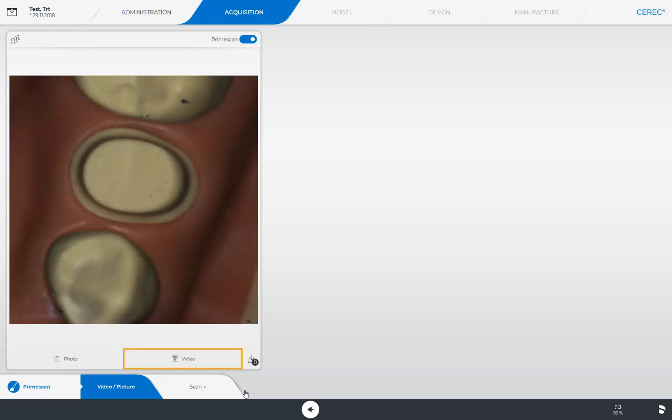By tapping the button to the right, you can record a video. The procedure for starting or ending a video is the same. After successful acquisition, all images or videos can be accessed by tapping the button to the right.